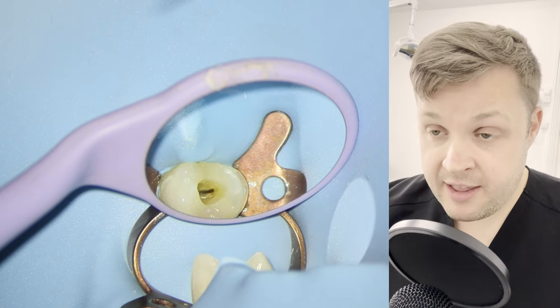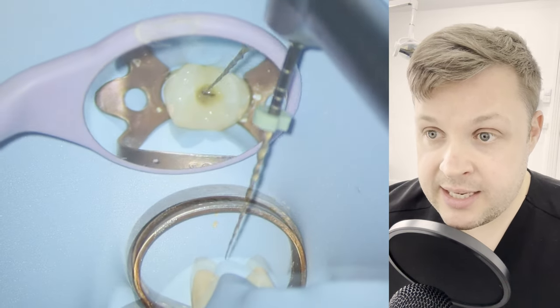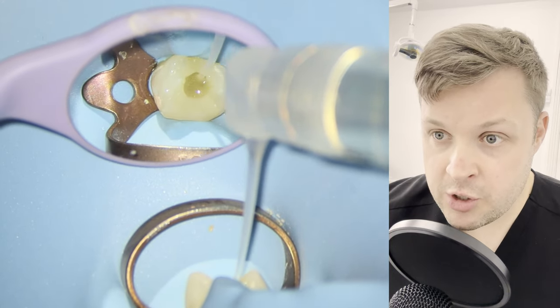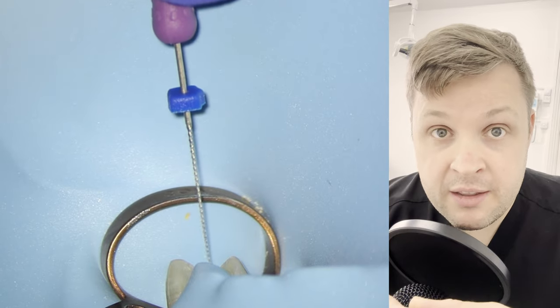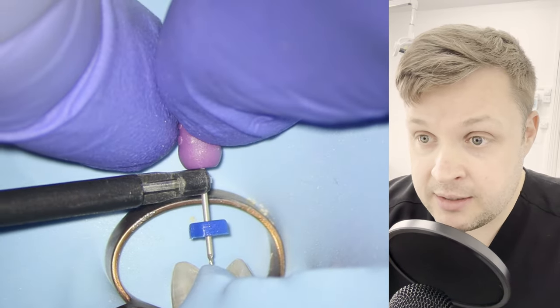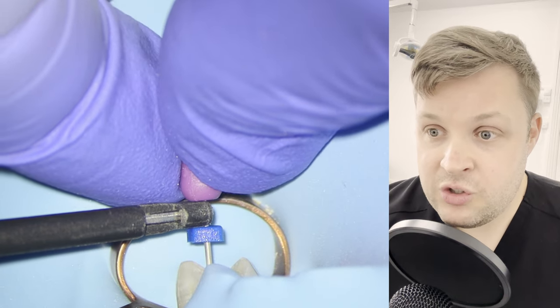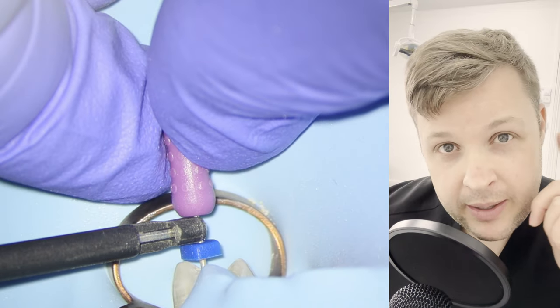I think the buccal canal is probably more patent than the palatal canal, so that is the first canal I've decided to explore. I'm going to use the high-flex 20 again just to really expand this orifice opening, and I'm using the irrigating tips just to make sure I get lots of irrigation in there. I like to fill the canal space and the pulp chamber with hypochlorite. Once I've opened up the coronal to mid-third, I'm now going to use a size 10K file — it feels like it's going quite easily to length — so I'm going to connect it straight up to the apex locator and very gently move it down to the apex until we hit zero.